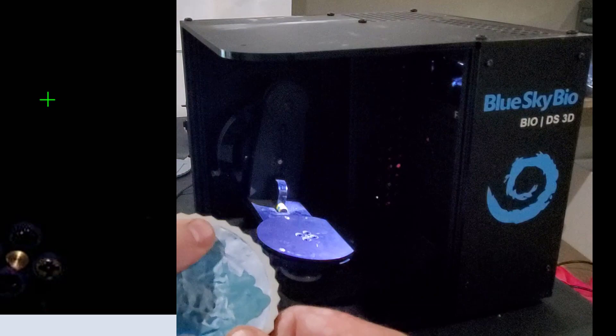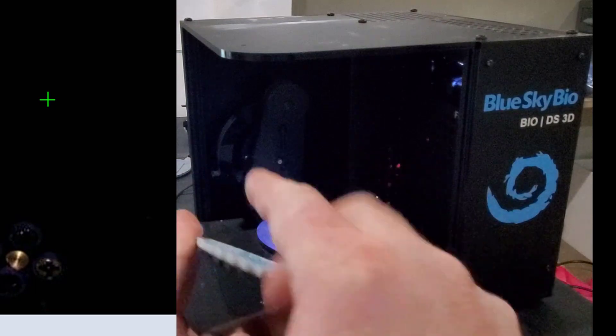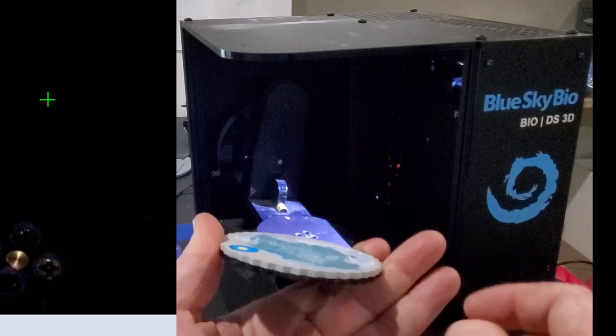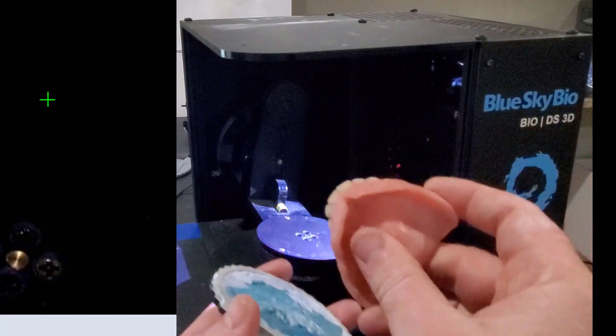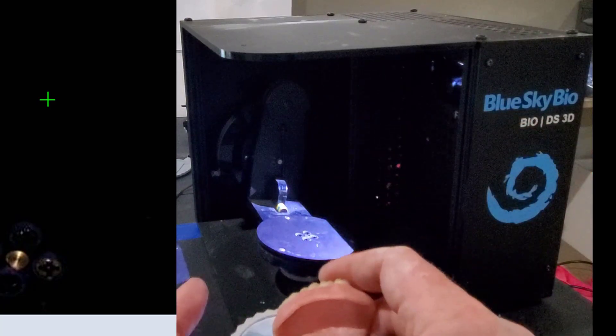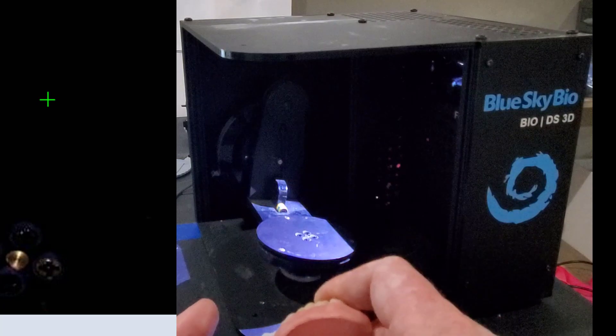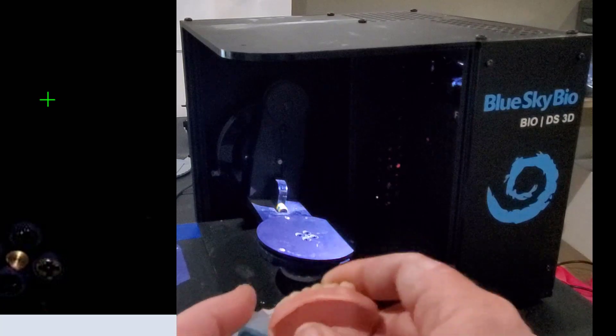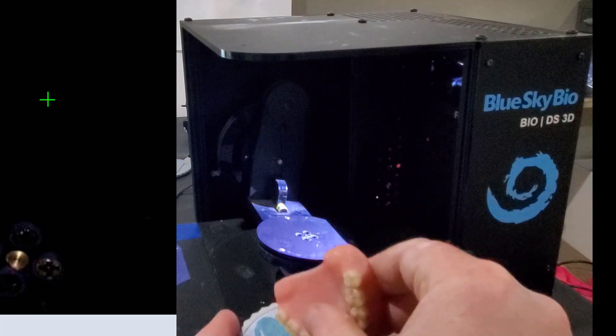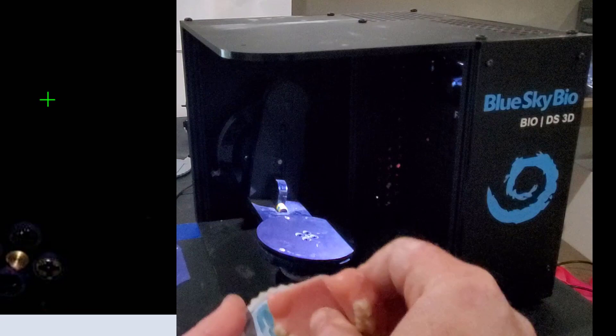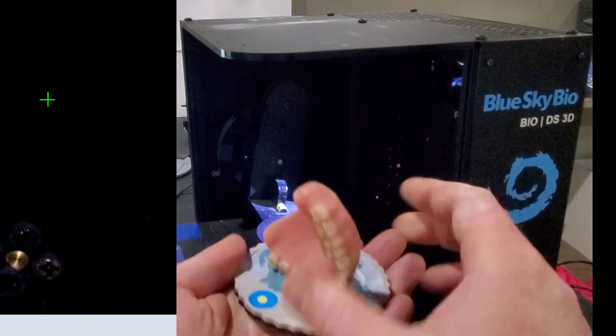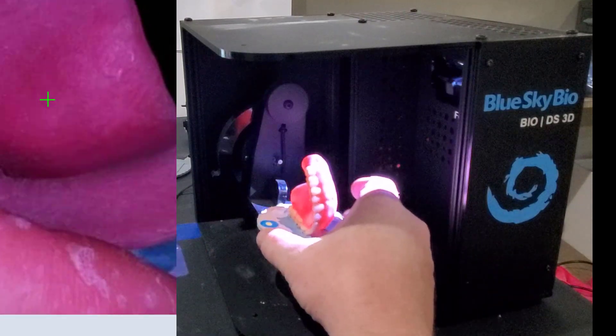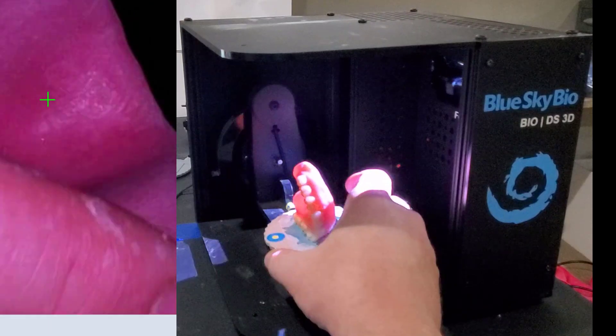You don't want any excess sticking up. It should just look flat across when you look at this. And we're just going to take our denture, and we're going to lay it on the side of the teeth. So what would be the buccal surface, and actually you want to put the tissue surface towards the camera first. So we'll just press that in, and then sit it in the scanner with the dot facing backwards.